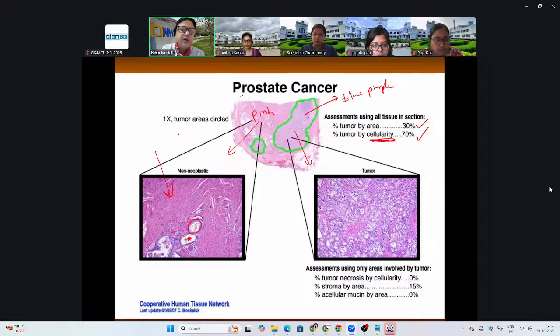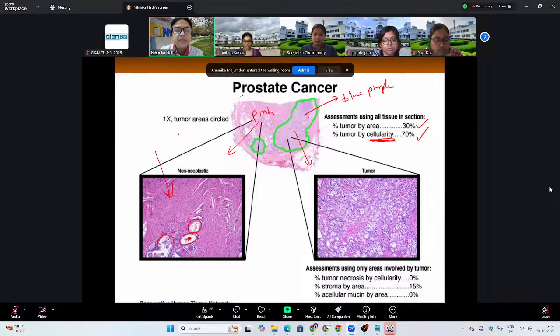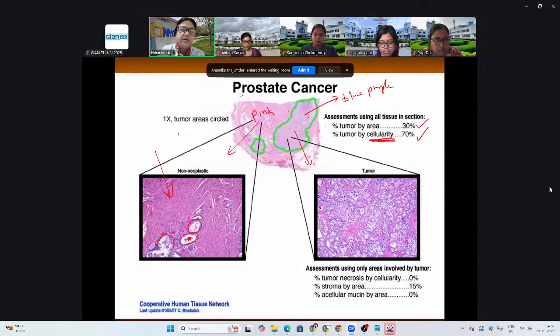Where there are ducts in a single layer, those are columnar epithelium and have to be slightly bigger, so they are slightly darker purple, but here they're very non-neoplastic. They look pretty good. Versus on this side, where it's much bluer. I can't tell just by looking at it, but it does not seem to be a homogeneous tissue, and there seems to be much more blue in locations and not so much pink surrounding it.